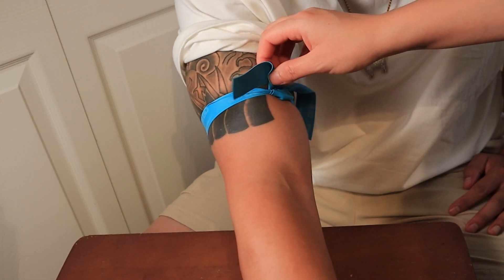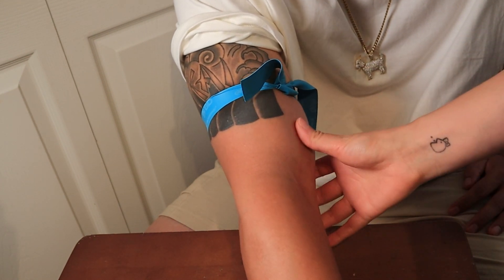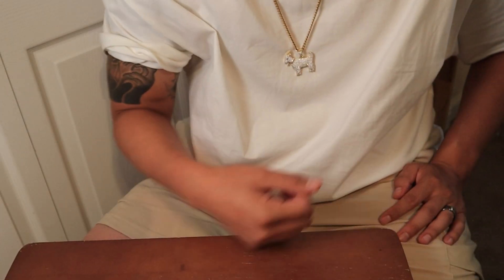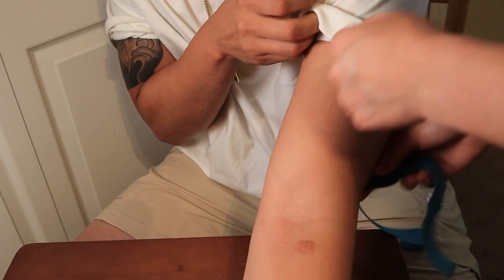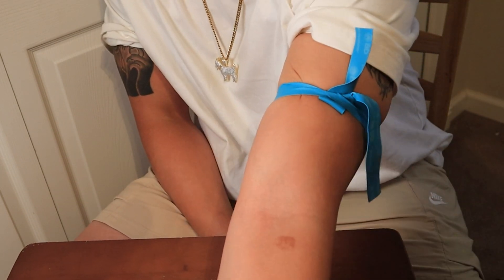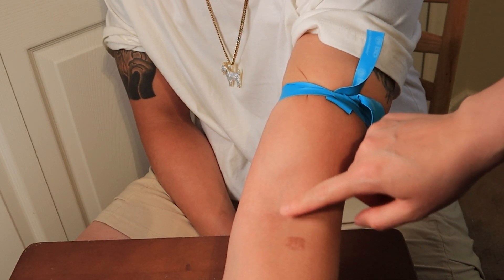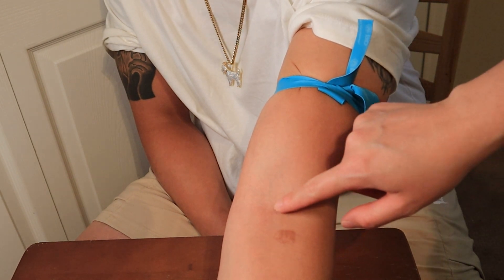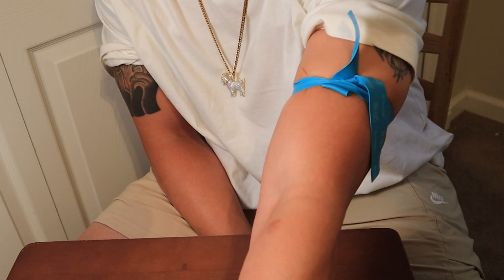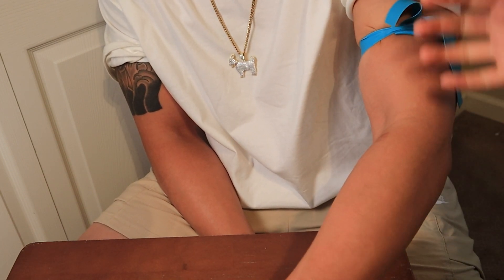If a patient tells you their right arm is good but you look and don't see anything, feel free to ask if you can look at the other arm — sometimes they get mixed up. Always look at both arms. Also make sure you tell your patient to make a fist; they can pump their fist to get the blood flowing into the arm.